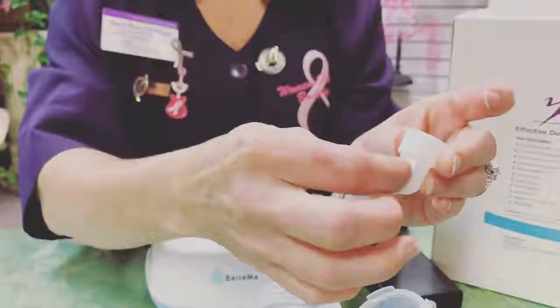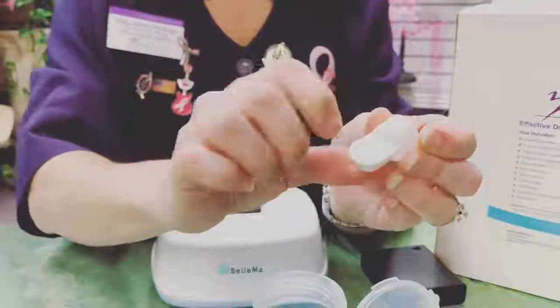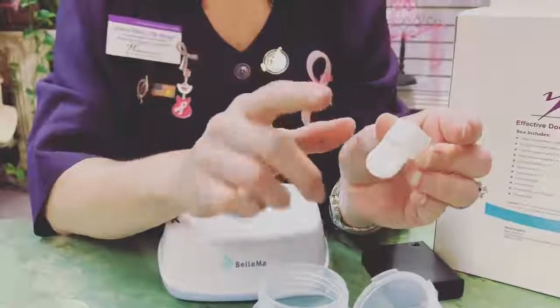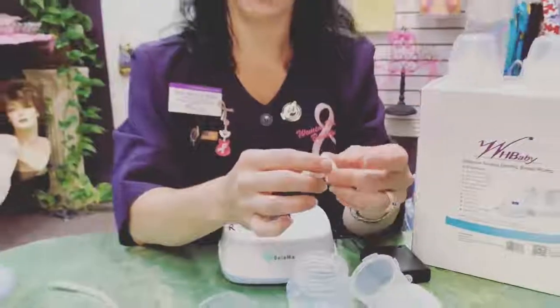You'll gently replace this back into the tiny hole. Make sure it lays down flat. If this flap cover has any rips, tears, or holes in it, you will lose suction. So make sure that you replace it when it's damaged. You have 6 extra in your box.